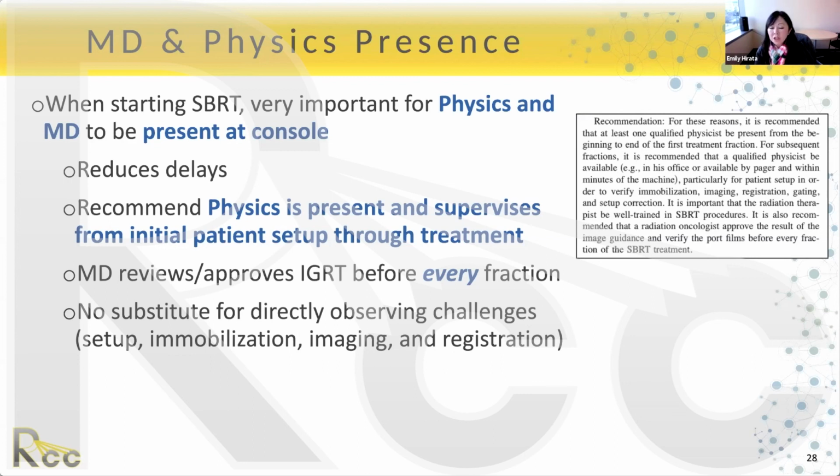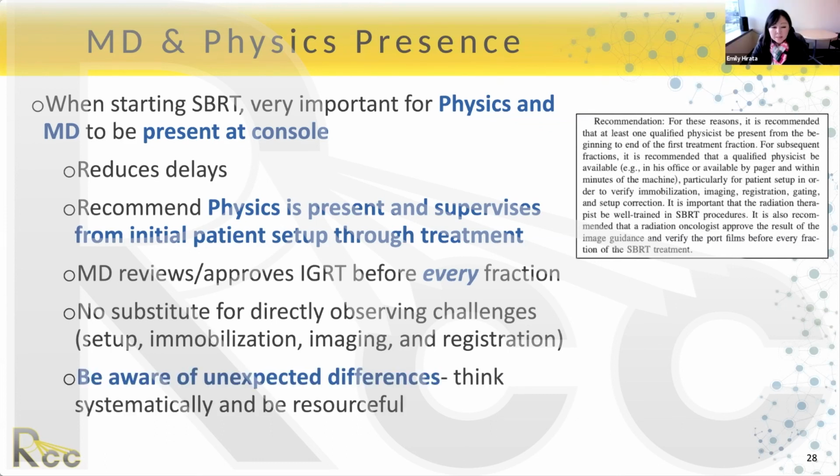So even if the shift was very small, we re-cone beamed, because for us, it was important to understand what the baseline is, what we can expect as a baseline for these shifts. Good question.